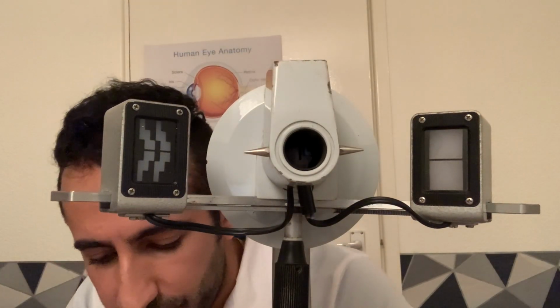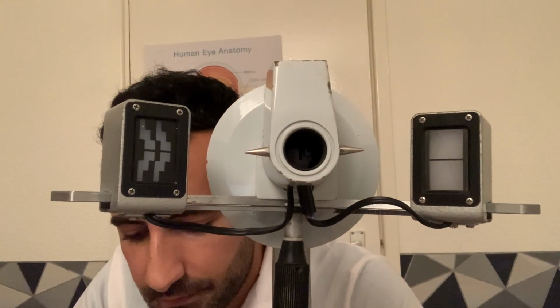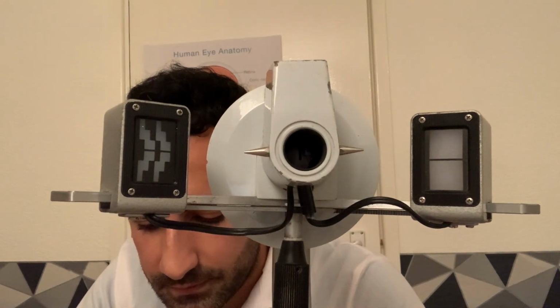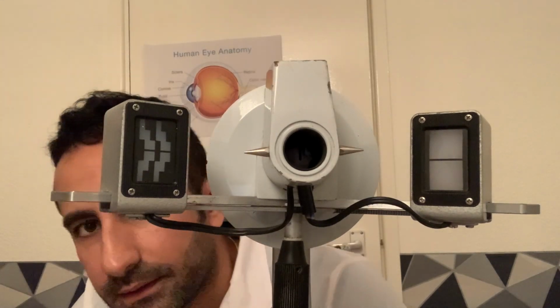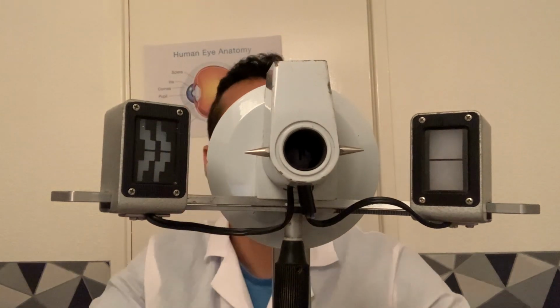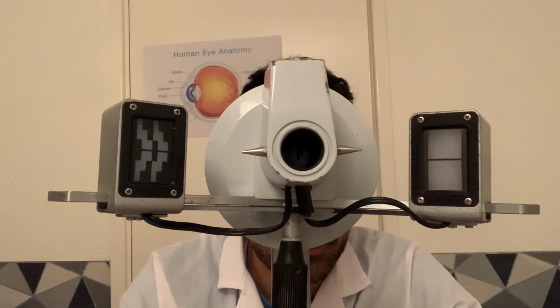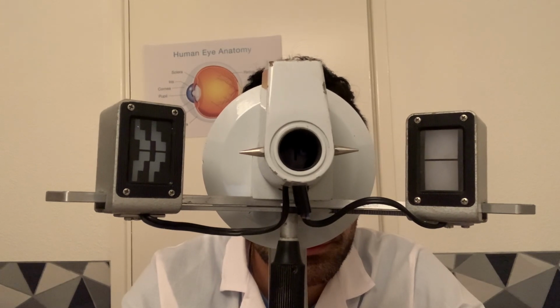Okay, so we're in position. So this is keratometry, starting with the right eye. Okay, let's get started. So your job is to look straight into the distance. I'll have a look through the machine here. Just be adjusting the distance, get the optimal focus.